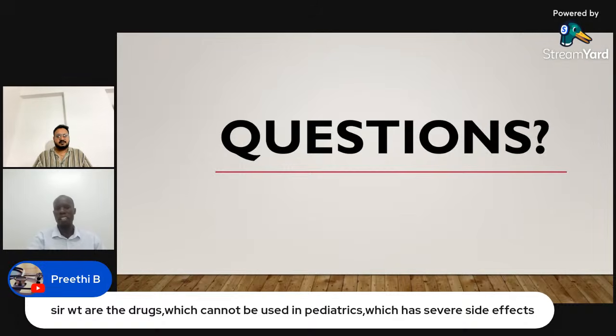Maybe someone might ask why. For example, this patient is having low sodium during the case. Can you add sodium chloride, normal saline, in the circuit? Will you opt for sodium bicarbonate, or maybe put some saline in your pump? I'll use half NS, half normal saline.